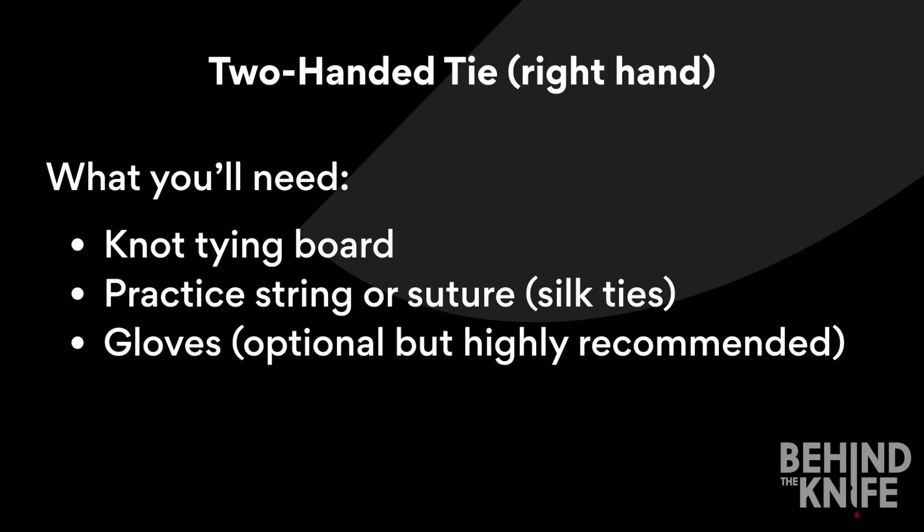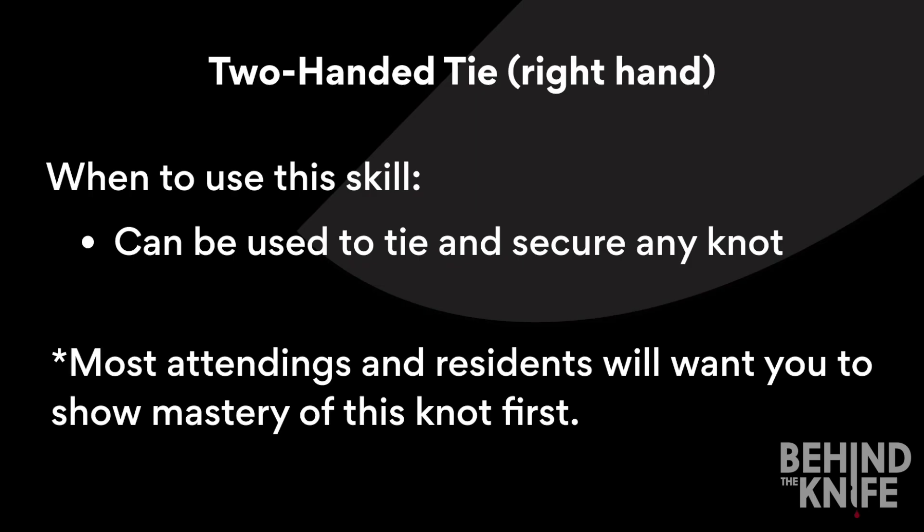It's always best to practice a skill the same way you're going to execute it in the operating room. You can use this skill to secure any knot, and most attendings and residents will actually want you to show mastery of this knot first before moving on to other ties such as a one-handed tie.